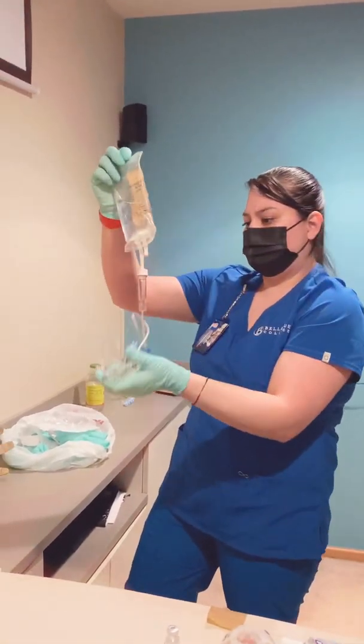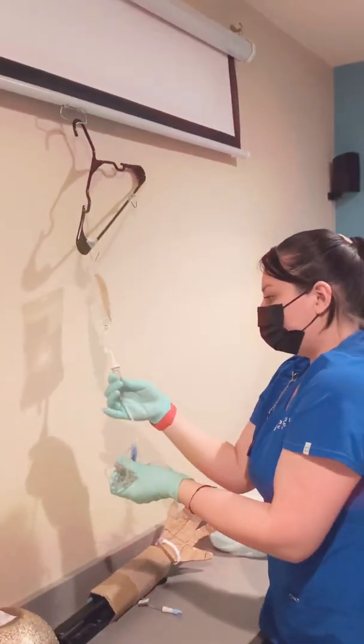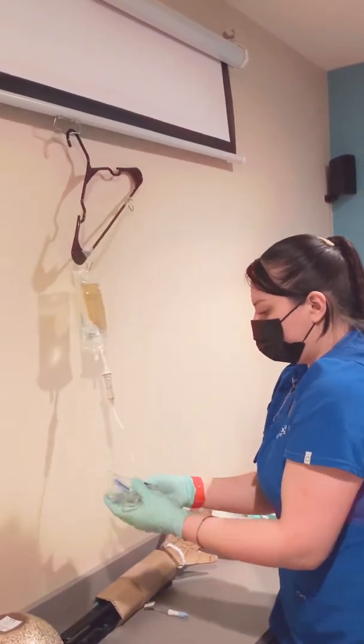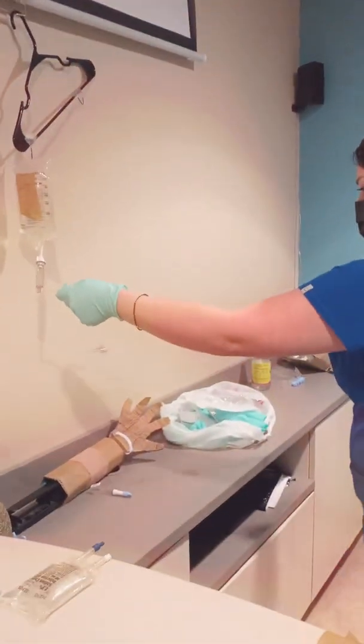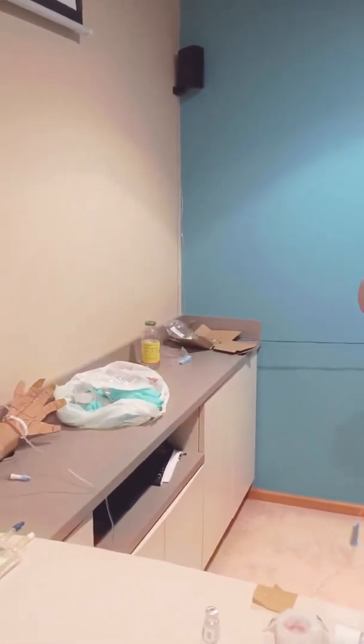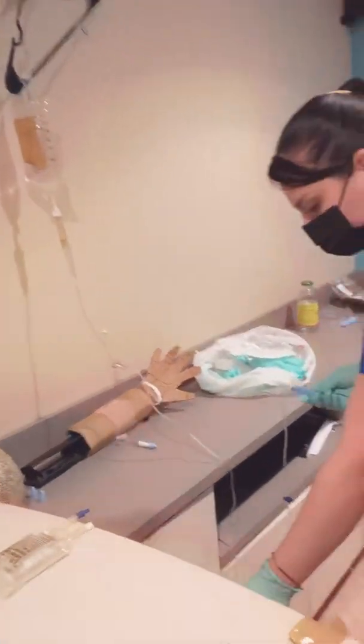Flip it over. I'm going to hang it. I'm going to fill my chamber halfway. Untangle my line here. And I'm going to prime it and make sure that there's no bubbles.